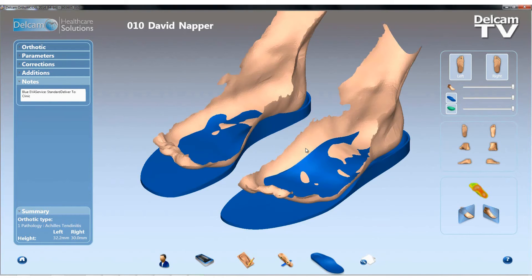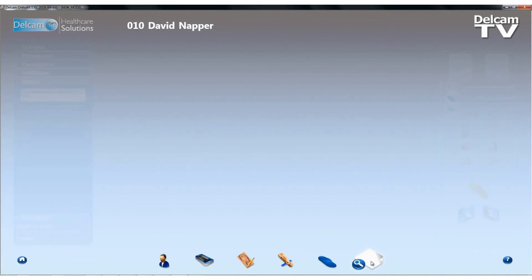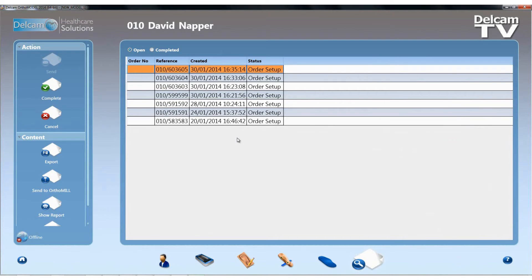As I hit the final button of the six-step process — the Orders button — all that information: the CAD, the foot scan data, the notes, and all the design information is stored in a single order which is added to our orders list.